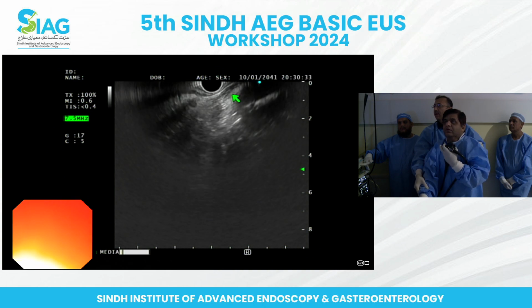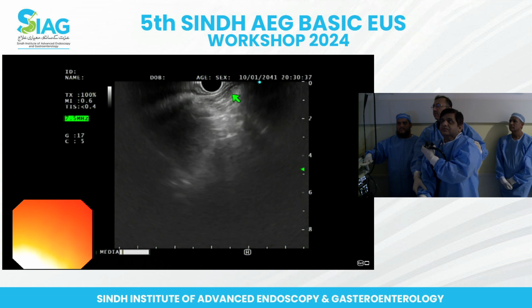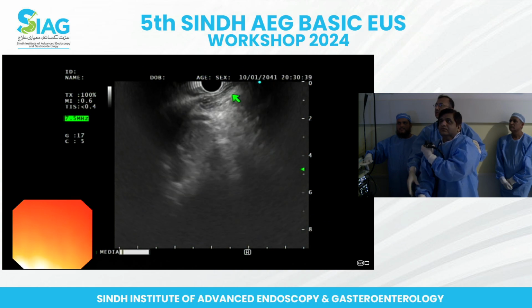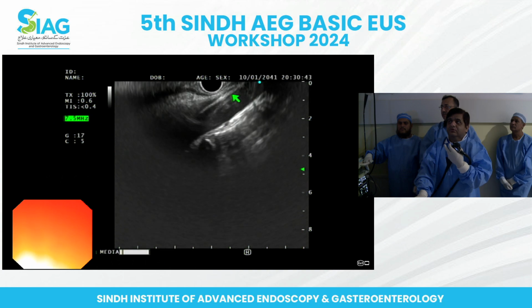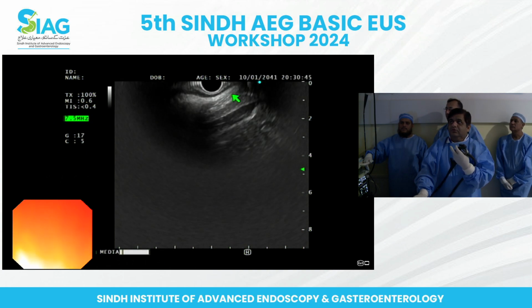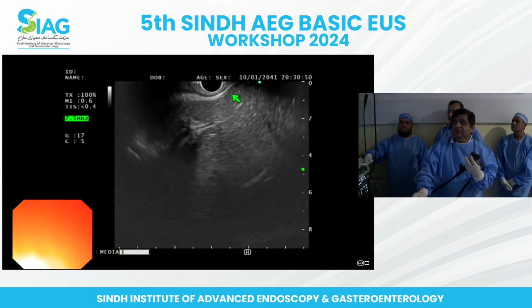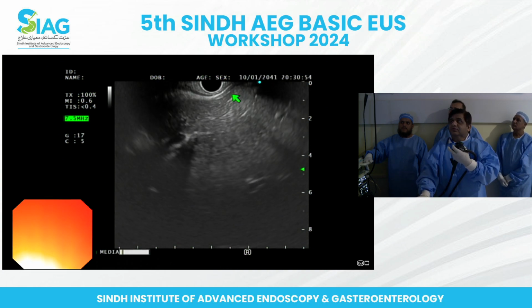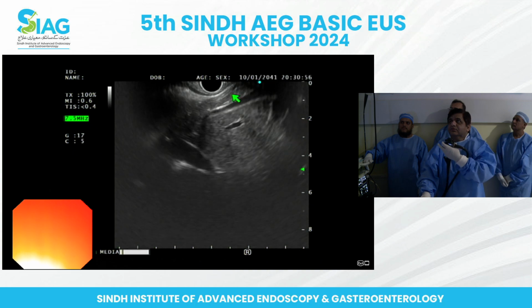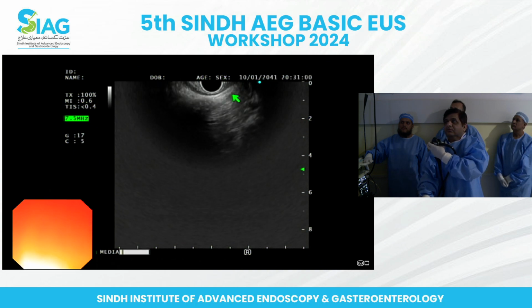And you need to step back. Okay, now that was a little better. Right? And if you don't see, go back to the previous station. Slight push and go back to the previous station, previous place. Once again, go to the pancreas. You see the liver, turn clockwise, identify the aorta, identify the takeoff of the celiac artery, and slide along the celiac artery to the pancreatic duct.